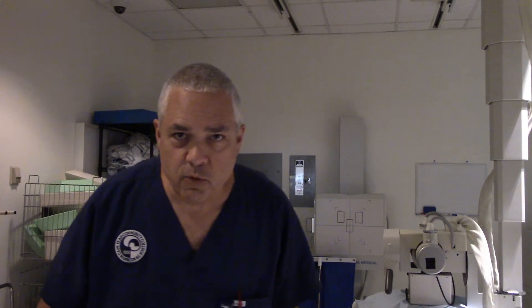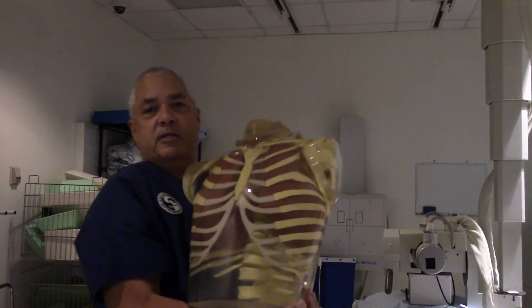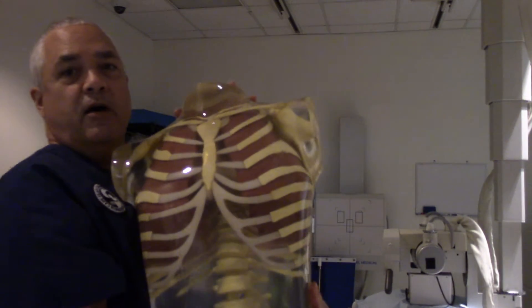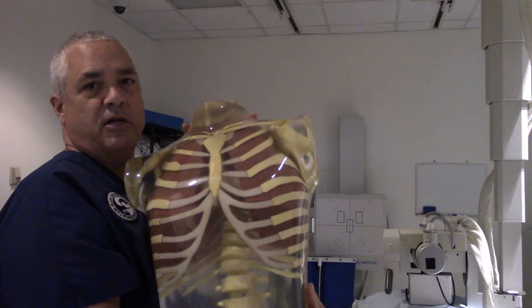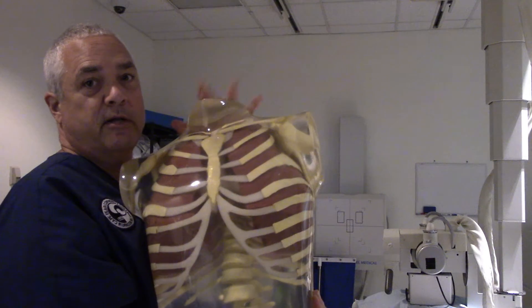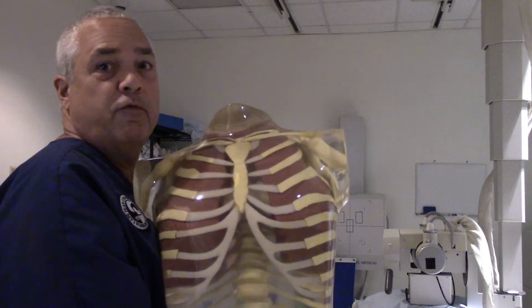We're also going to be testing the angulation today. Whenever you're doing chest x-rays — AP chest, stretcher chest, wheelchair chest — the central ray is supposed to go perpendicular to the sternum. You might wonder how we'll show different angles, but it's not going to be a problem because I happen to have this little jewel. I can't hold this thing up very long because it is exceptionally heavy — about 50 pounds — so I'm going to put it down before I drop it.